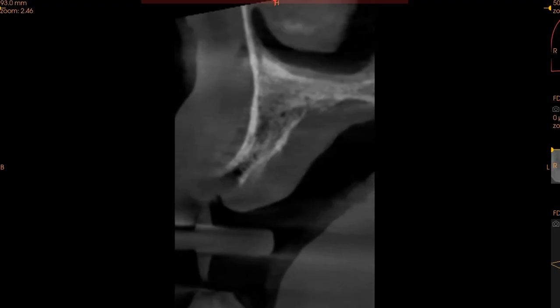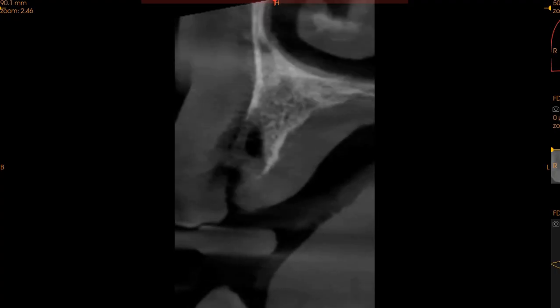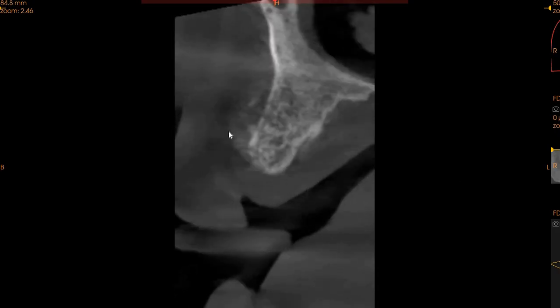Moving to the region of the lateral, we've got a slight bit of an extraction socket here. Again, if this area is to be measured, we've got 6 millimeters of ridge width below the crest, mid socket level, and 11 millimeters of height. D3 bone quality. Region of the canine, we've got slightly good bone here, 6 millimeters of ridge width with a good 18 millimeters of height.